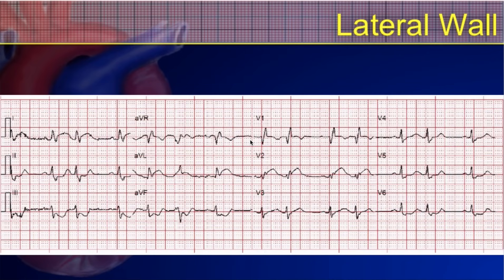Here's a lateral wall myocardial infarction with changes in the high lateral leads — leads 1 and AVL. When we see changes in AVL, we immediately look at lead 3, and we do see reciprocal changes in all of the inferior leads, giving us enough to identify an acute myocardial infarction. Additionally, just as the septal infarct showed high lateral changes, this high lateral infarct shows septal wall changes — a pattern that is relatively common and worth recognizing.